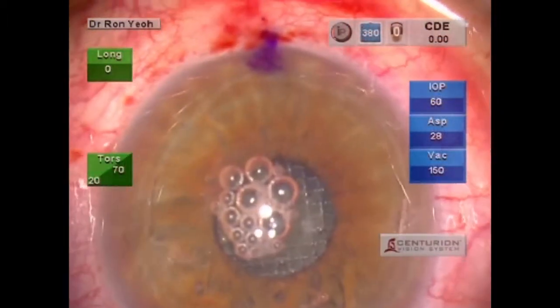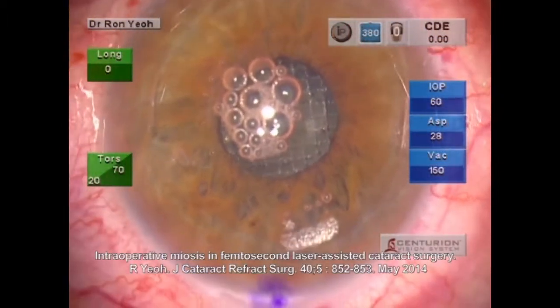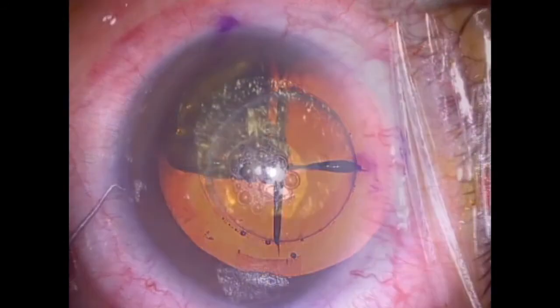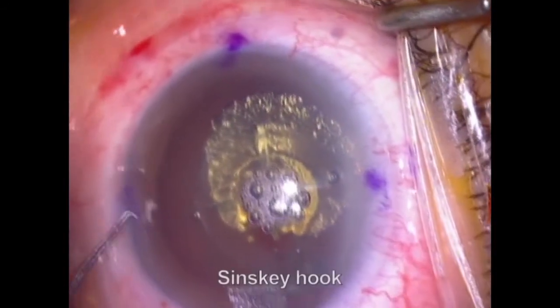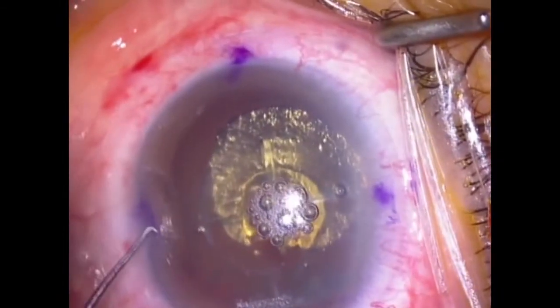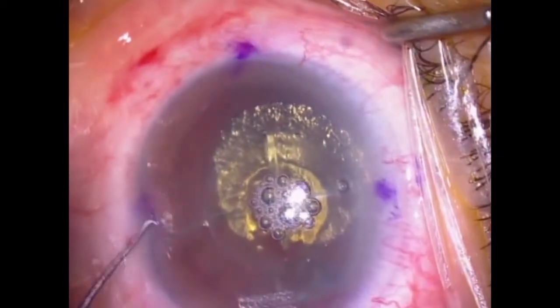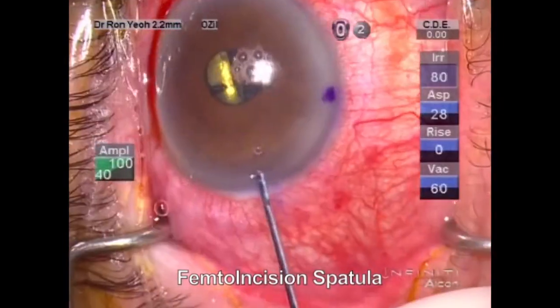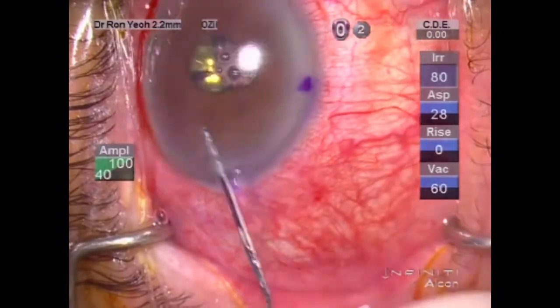Post-femto laser miosis can be prevented by the simple expedient of applying 2 drops of a non-steroidal anti-inflammatory drug with the pre-op dilating drops. As with femtolasik flaps, femtolaser incisions can be challenging to open, and here a Sinskey hook is clearly the wrong tool. A specifically designed femto incision spatula opens the incisions up easily.